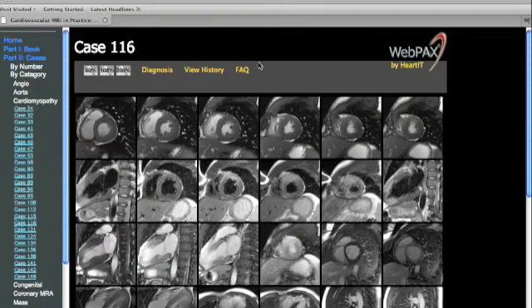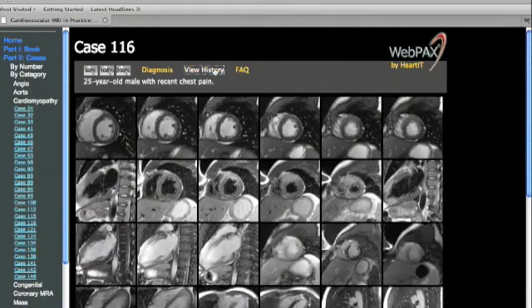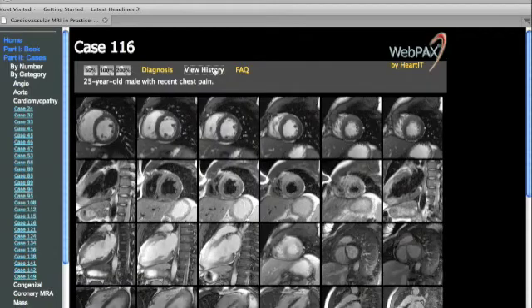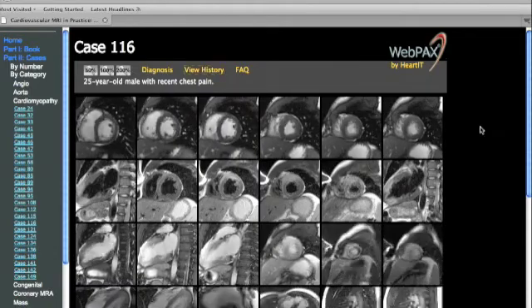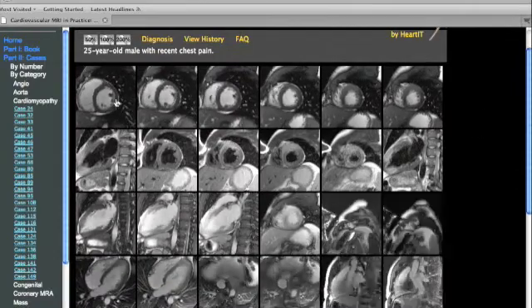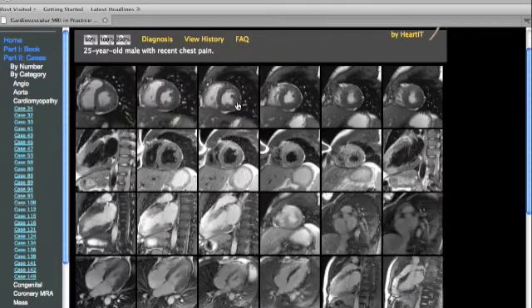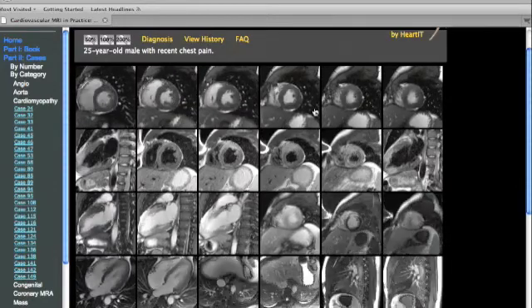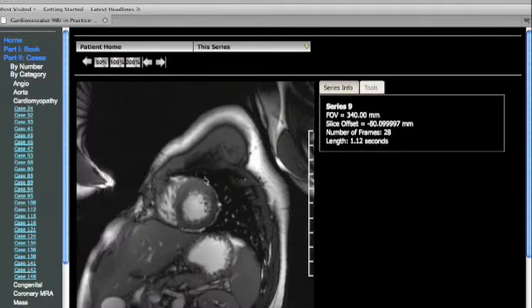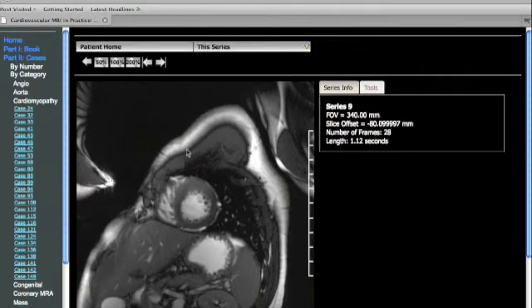We'll start by noting the history, which is that the patient is a 25-year-old male with recent chest pain. This case is displayed as a series of short axis images in the top row, which demonstrate overall normal function. However, there does appear to be focal thickening of the anterior wall with apparent slight increased signal on these true FISP or steady-state free precession images.